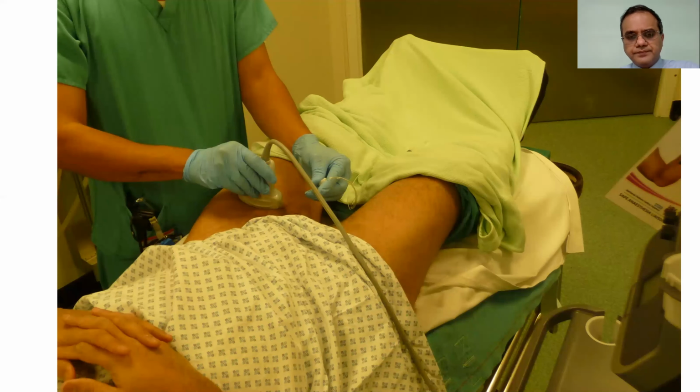To block the nerve, I will stand on the side of the block. The machine will be on the opposite side, so everything is in line. So I can see everything happening in front of my eyes, and I'm not twisting and turning. The probe that I'm using is a curvilinear probe. Needle is inserted in plane.